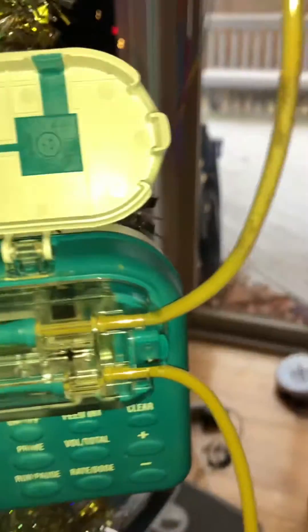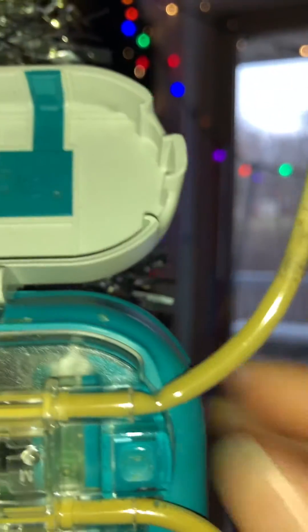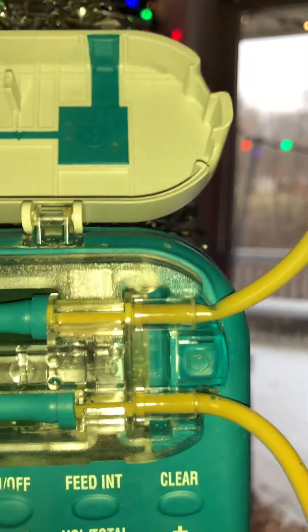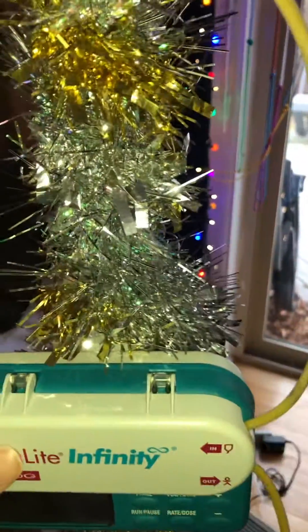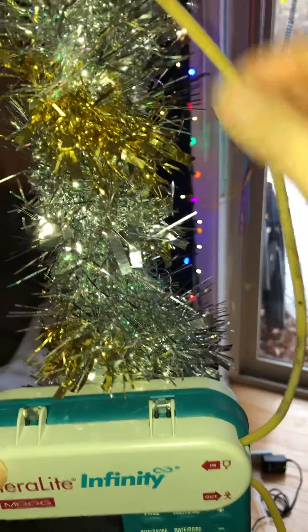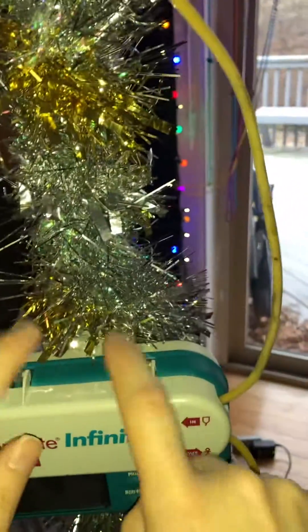I realized there's a teeny tiny little kink right there, and that is what is keeping the food from flowing. So what we're gonna do is try to manipulate the arm — the placement of the bag versus the placement of the pump.